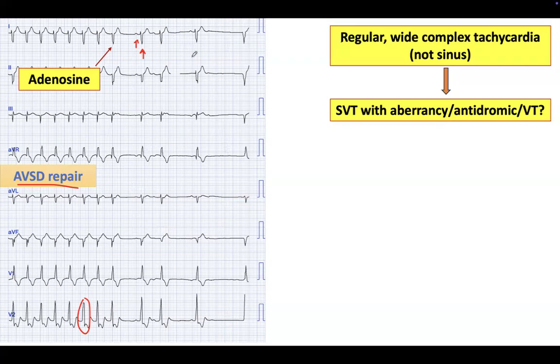Yeah, I mean, it looks post dropped beat, of course. Guys, this is post adenosine, right? So the patient was tachycardic, you suddenly stop the tachycardia. You don't expect immediate regularity of your sinus rate, right? So there's a P wave, QRS, T. P looks sinus because positive in lead one, lead two, lead AVL, lead AVF, most likely sinus, okay?